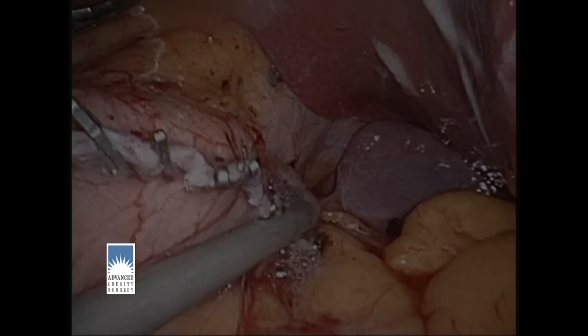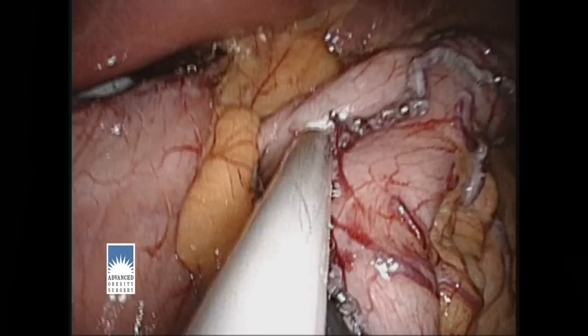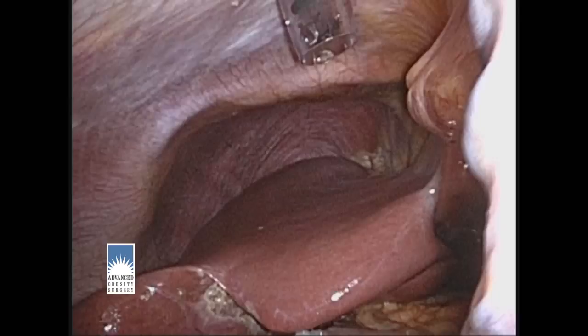Once we've placed this fibrin sealant, the sleeve gastrectomy is complete. Now we can take out the portion of the stomach that's been detached. We pull this out through one of the incision sites where one of the ports was, and it comes out fairly easily with no further injury.